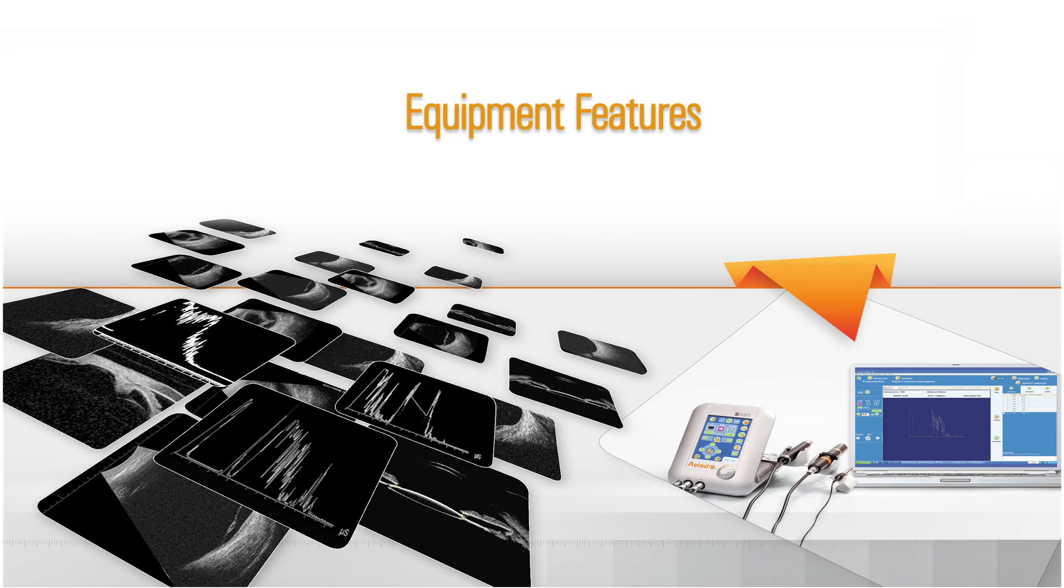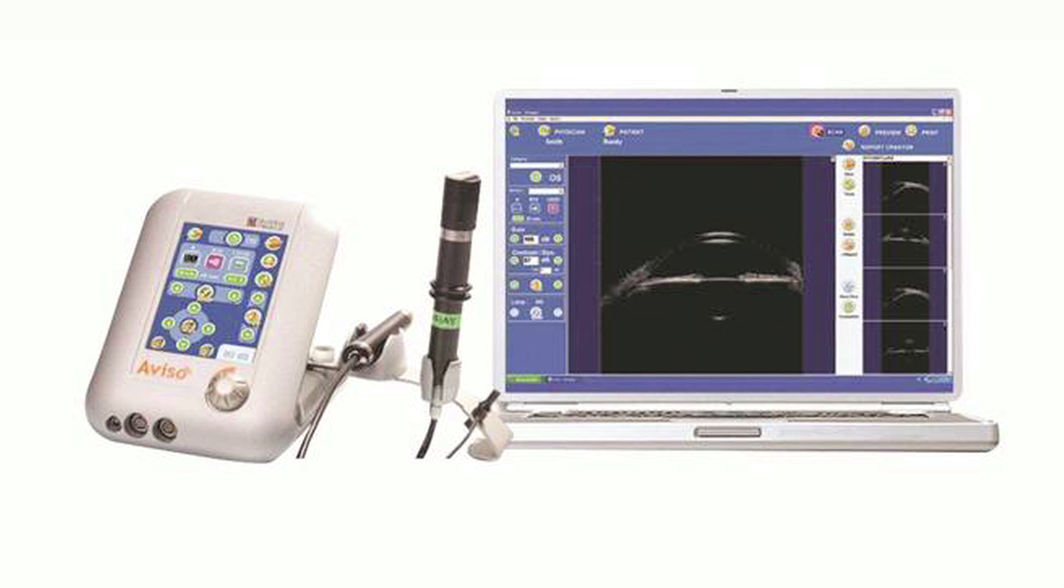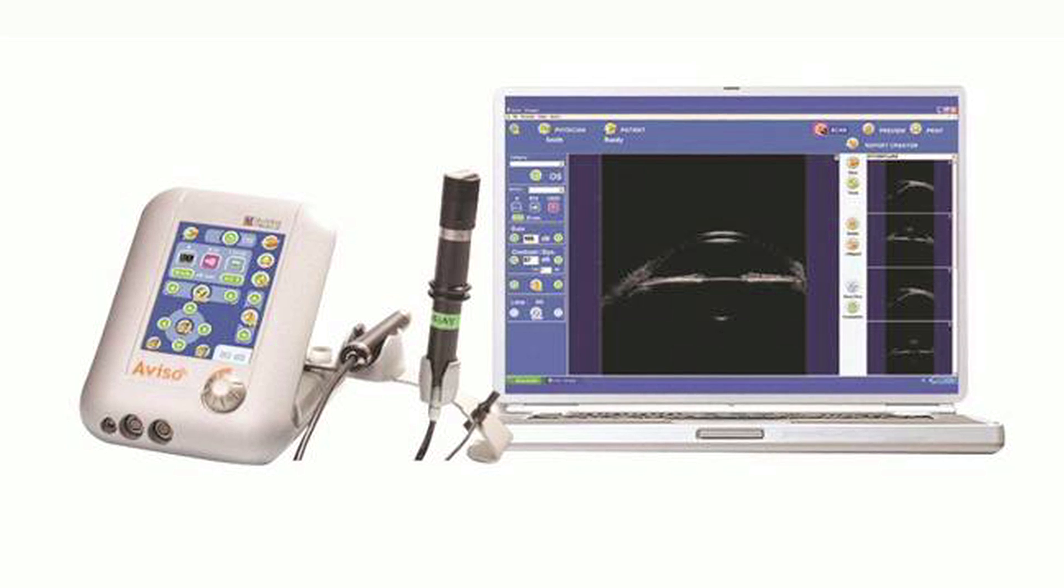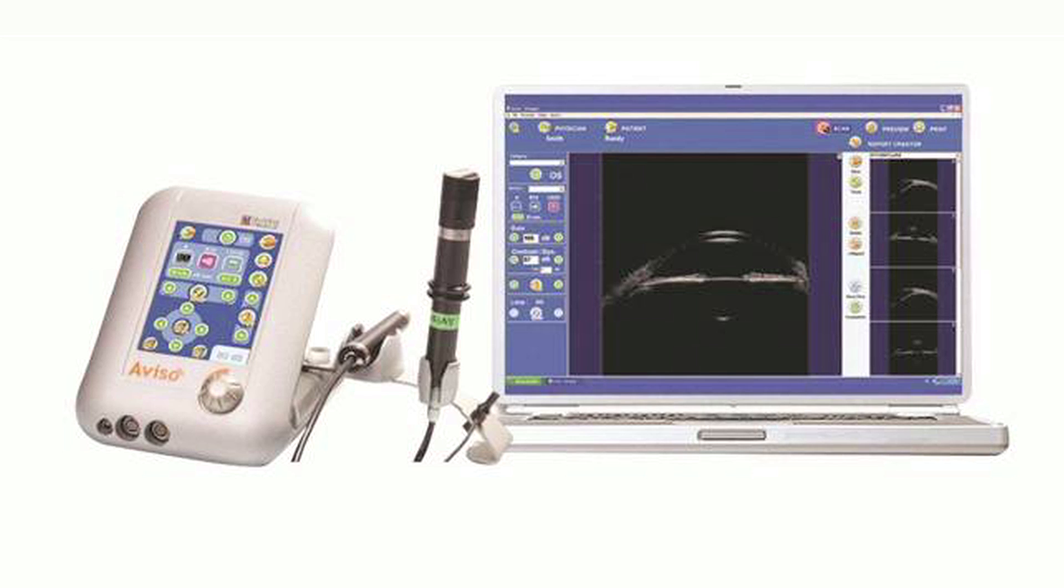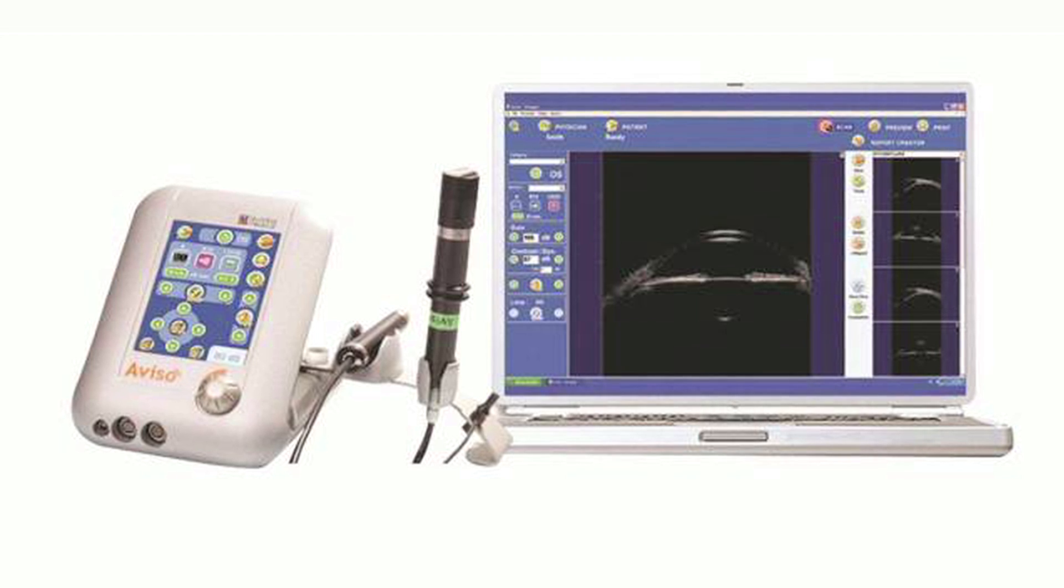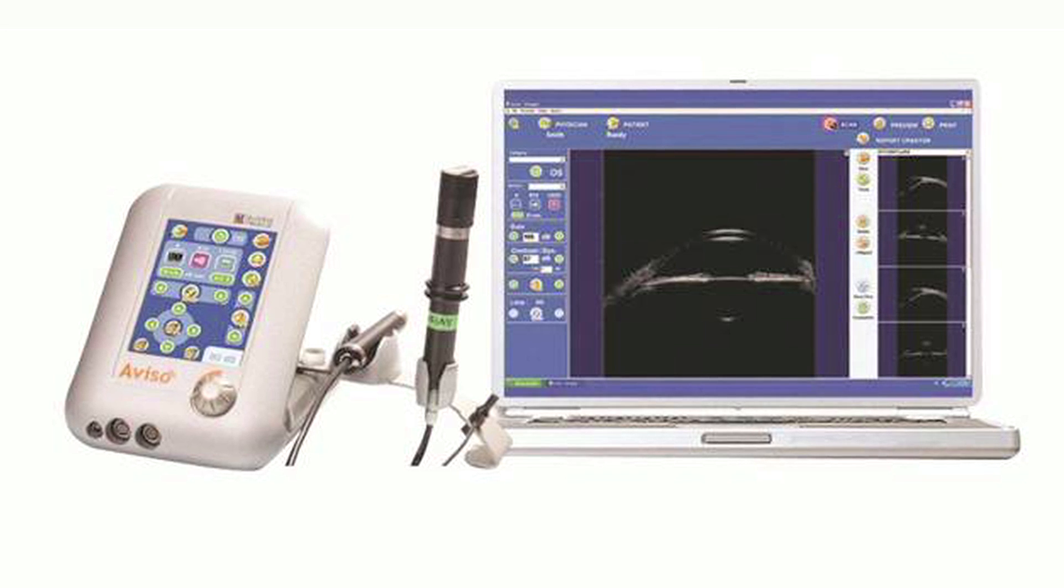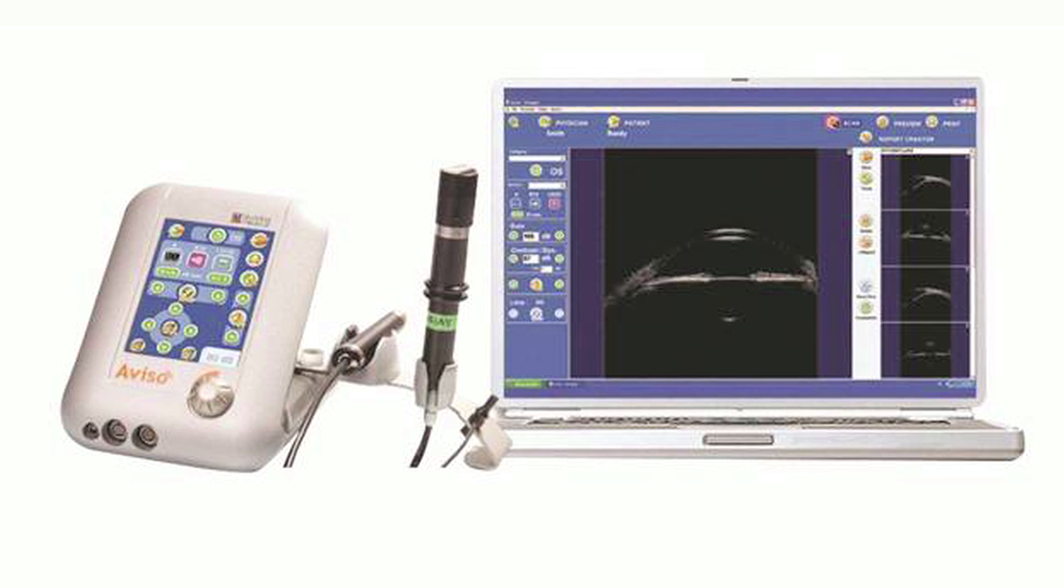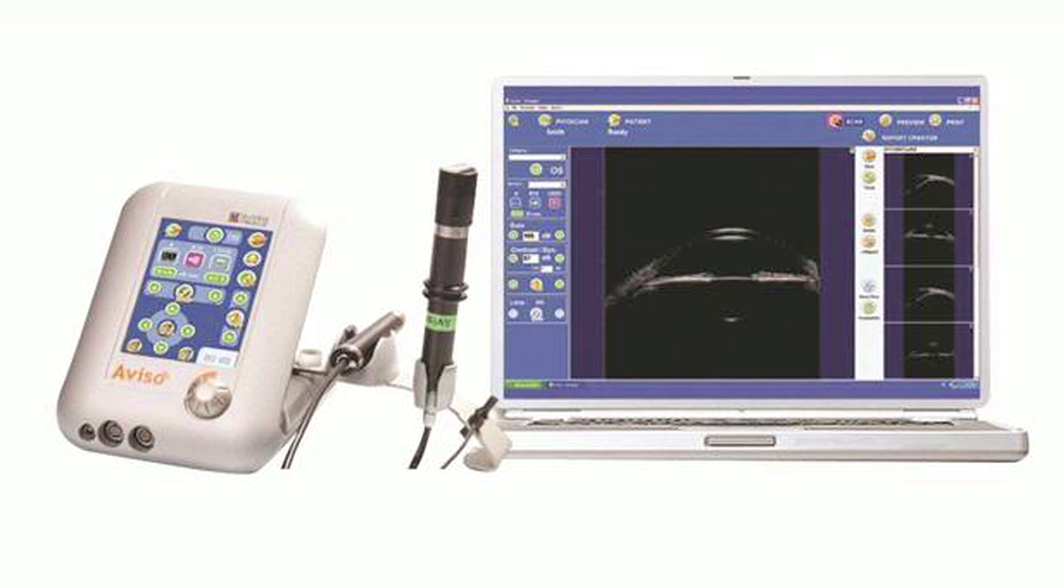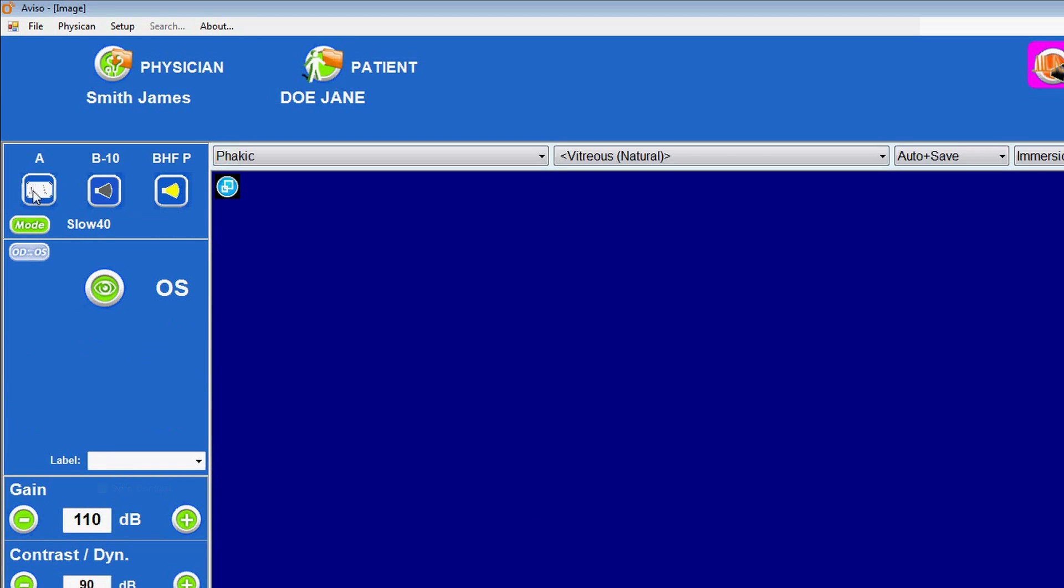Equipment features. We will now review some of the features and techniques for using Quantel Medical's Aviso ultrasound system to perform A-scan biometry. The Aviso is a modular ultrasound platform featuring a portable, compact main unit with a user-friendly touch screen connected to a laptop or desktop computer through a USB cable. Image acquisition can be controlled via the touch screen or the computer, where data and images are displayed. Press the biometry A icon to access biometry mode.